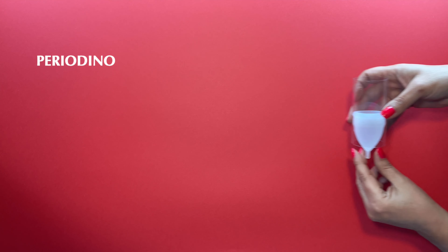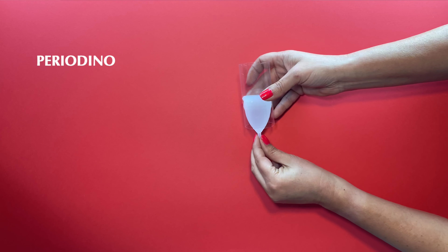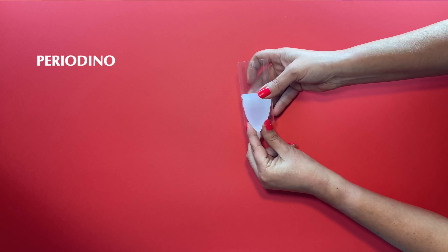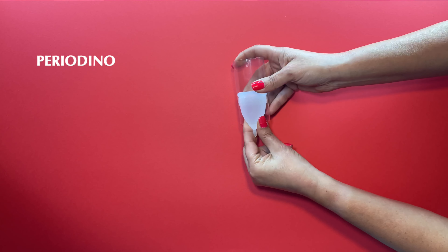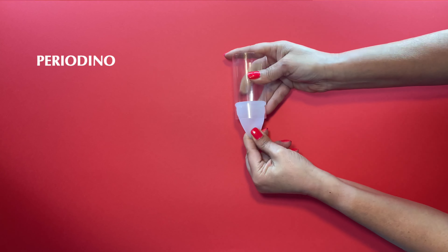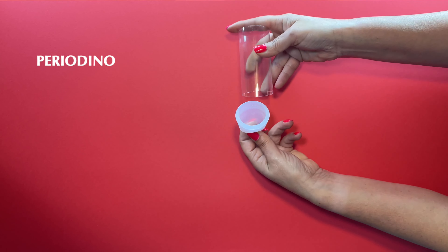Most importantly, whatever your cervix type, never remove the menstrual cup without first breaking the vacuum effect. To do this, locate the base with your fingers and pinch it before removing it — this will break the vacuum. Then hold it while you gently move the cup from side to side outwards.